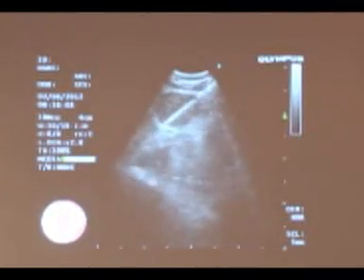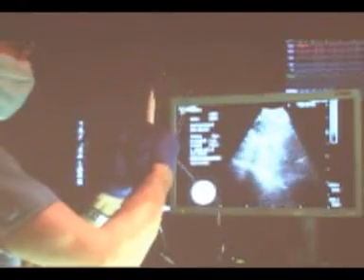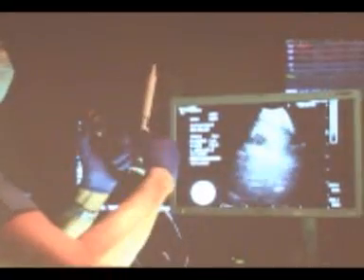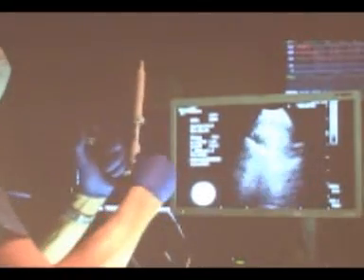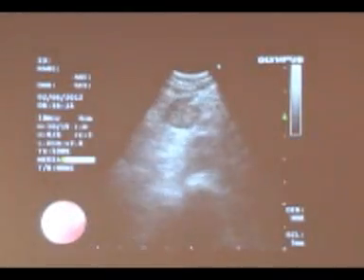It's important also to keep an eye on what you're suctioning out, because once you start seeing blood, as you will here in a second, it's a good time to stop. You really don't want to have blood in your aspirate because it just dilutes out the specimens. So once that's done, then you give your needle to your assistant and go make your slides.